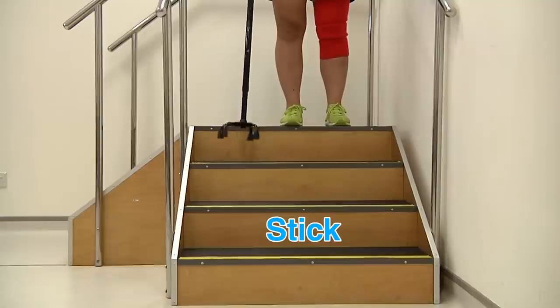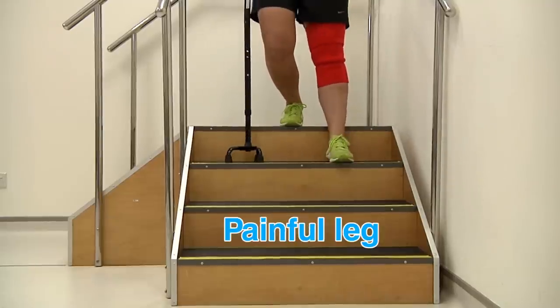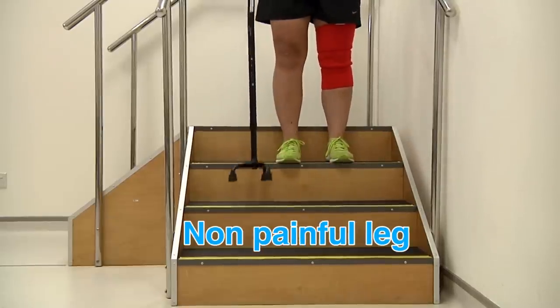To go down, place your stick down first. Lower yourself down with the painful leg, followed by the non-painful leg.